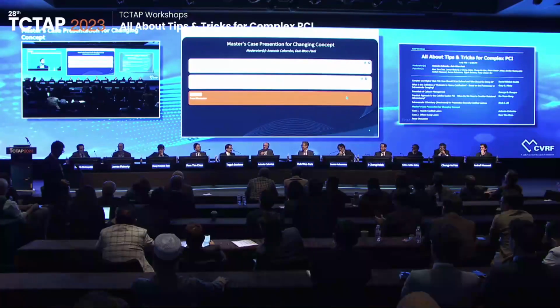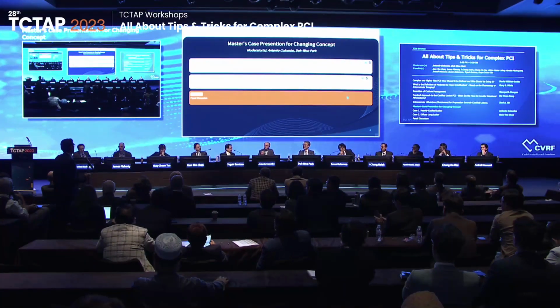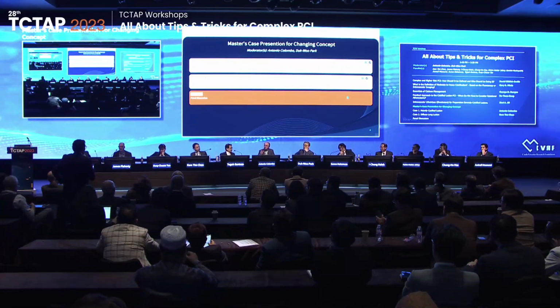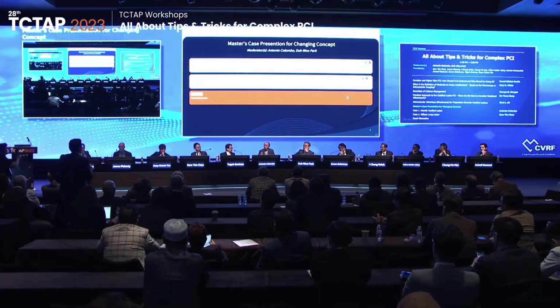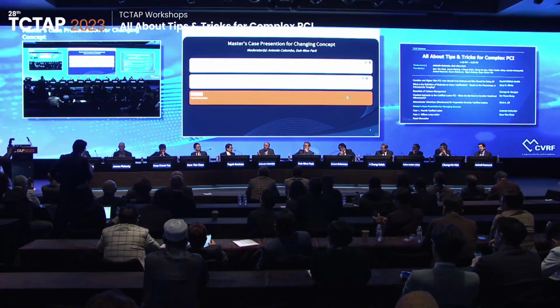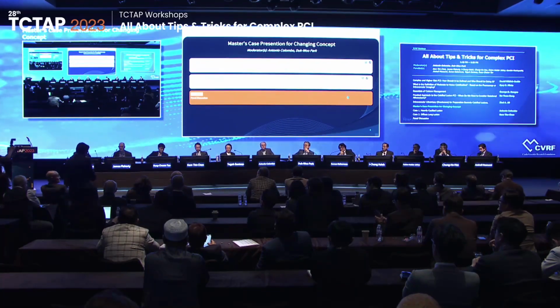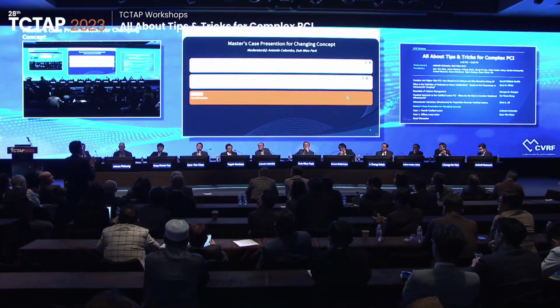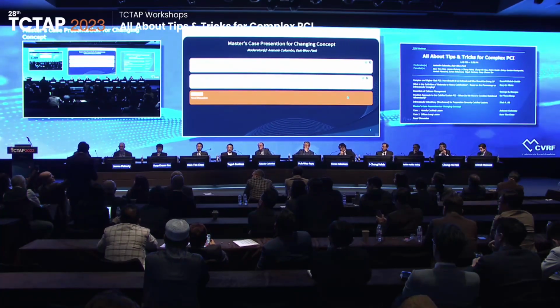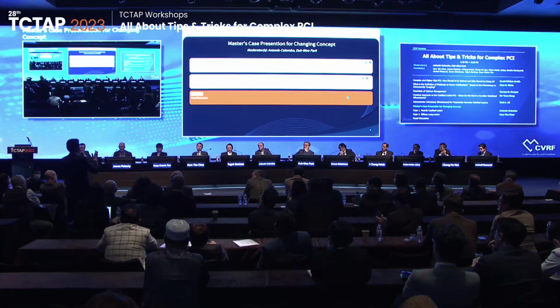Regarding lithotripsy, there are some situations where you would use lithotripsy at the very beginning. Why not always try a high pressure balloon first? That's a great question. Theoretically, an NC balloon should create a fracture in a single plane.